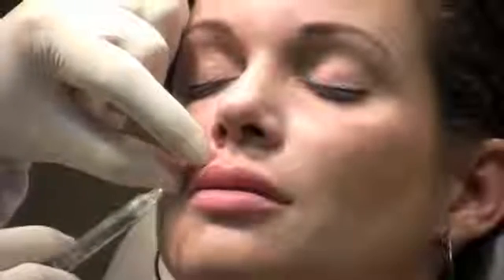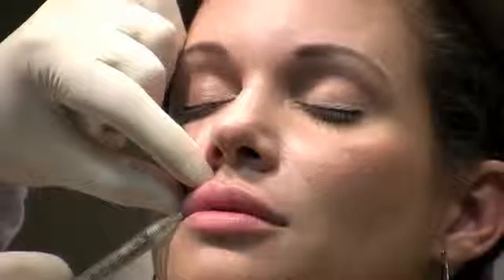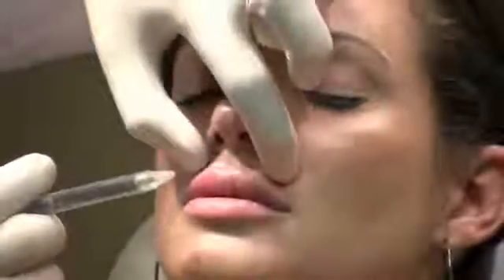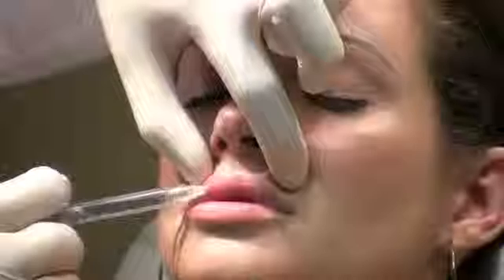I like to keep the patient's mouth slightly open, not wide open, just slightly open. I start penetrating the needle and uniformly injecting. I like to inject as I'm entering to push away any small blood vessels. That decreases the chance of bleeding and bruising. It's very common to bleed and bruise from the lips. They're very vascular, but doing that technique is a nice modification which actually lessens the chance of bleeding and bruising.